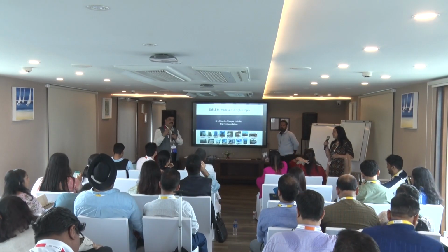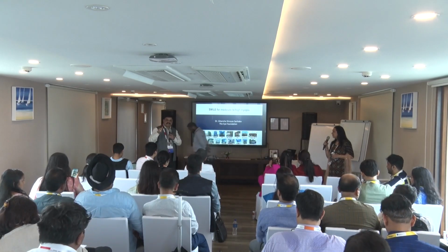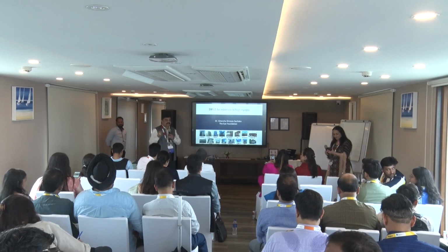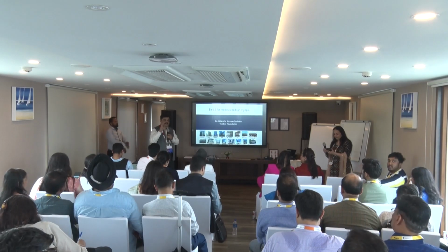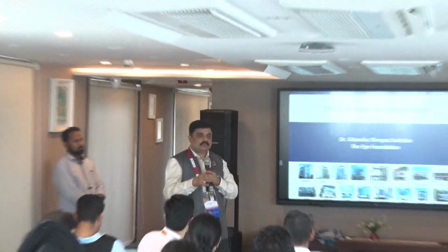So it is once again depending upon the type of case, type of refractive error, and also the geographical distribution. Like I was always talking with Dr. Rohit Shetty, he always says that people who practice in coastal areas tend to do less PRK than LASIK just because the chances of haze are quite high. I even faced it with some patients. In such patients, if you have a good option for both LASIK and PRK, I think we should go ahead with the LASIK only. Of course, thinking about risk apart from haze, there is much less risk in PRK than definitely with the LASIK.